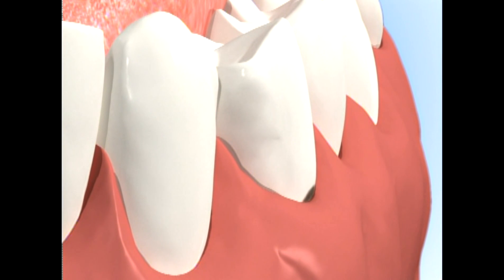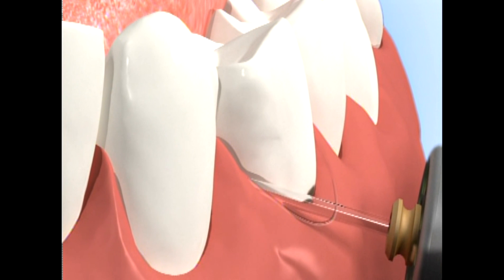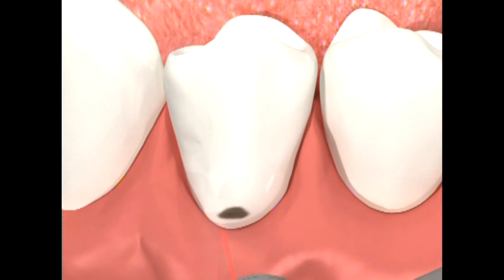To start the cavity prep, first check to see if access to the decay requires the removal of gingival tissue, and remove any gingival tissue necessary to reveal the decay. Start about one centimeter away from the tooth surface and slowly advance toward the decay until ablation can be visualized. Slowly move the laser around to remove the decay completely, frequently stopping to check the cutting depth and focus-defocus accordingly. When the preparation is completed, proceed with checking for softness in the structure using an explorer, excavator, or a slow-speed round burr based on your preference.